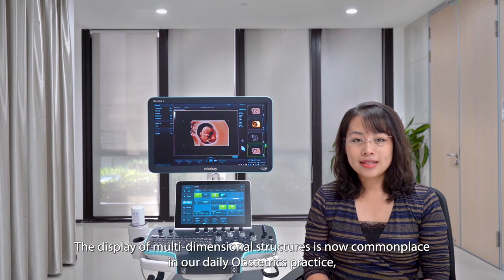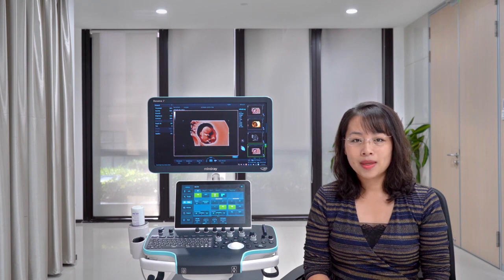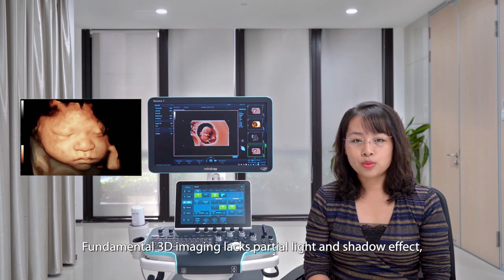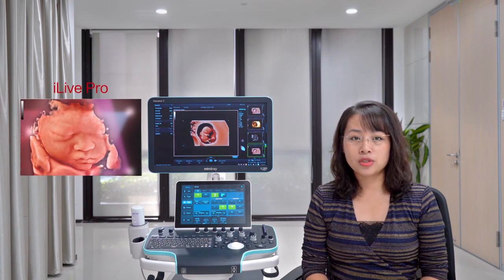The display of multidimensional structures is now commonplace in our daily obstetric practice and makes the reading and communication with patients so intuitive. Fundamental 3D imaging lacks partial light and shadow effects and has the limitation of highlighting some specific 3D tissues.